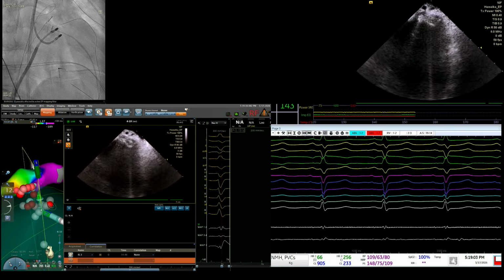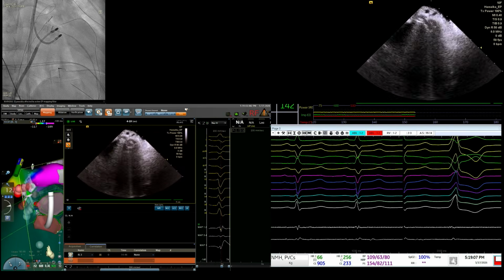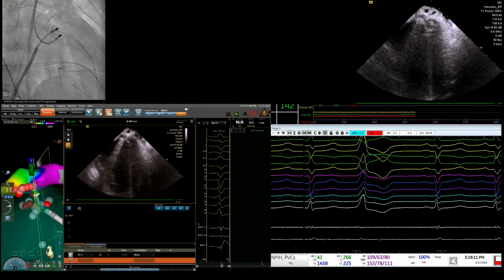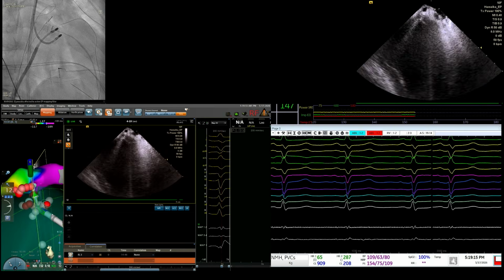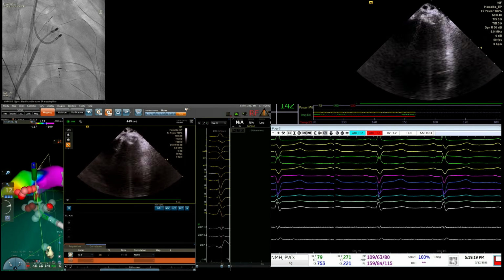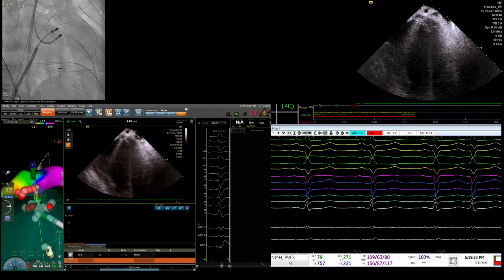This is now a slightly different morphology. It's more positive in that one. It's higher up, more medial or more lateral. But you can see that in a way we're changing the exits of this region. Even though it looks early on the back, this one looks a little different. It's only happened a few times, but we're going to keep an eye on it.